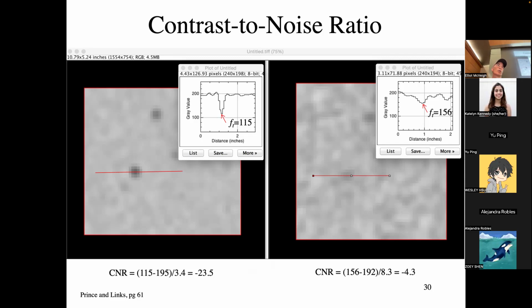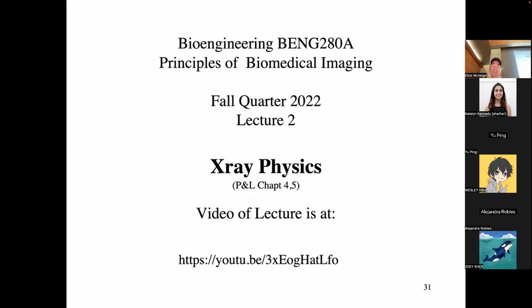It turns out there's this thing called the Rose criterion, where if you have a signal to noise of 5, that's the threshold for a machine to operate at and get about 95% of the calls right. Humans will not usually operate there. If you present a radiologist consistent pictures that have a signal to noise of 5 and say you have to make your call based on that, they will throw that back at you and say, buy another machine. What is this thing? They don't like working at a signal to noise of 5. They like working at something like 10. However, machines will work wherever you program them to work. Radiologists work at their own thresholds. They have different thresholds, so it's hard to keep up.